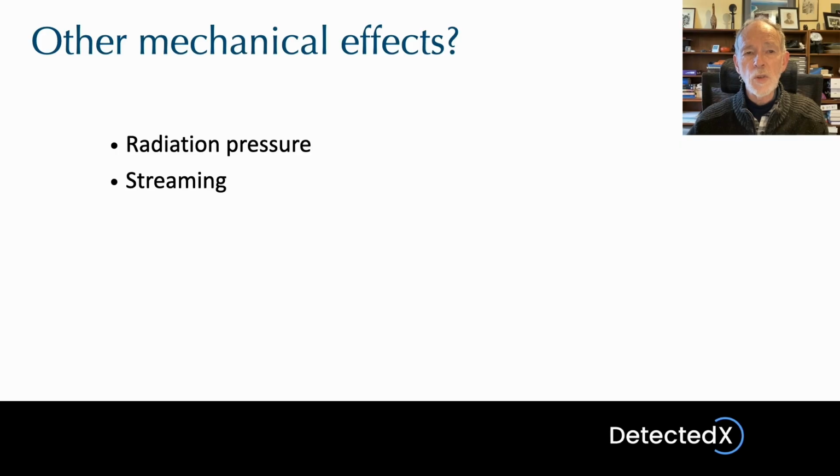So you'll get a stream of fluid and particles within that fluid streaming away from the transducer. Is radiation pressure likely to be harmful? This is unknown. It is possible that there are circumstances where it is potentially harmful at clinical levels of exposure. So it is continuing to be investigated.